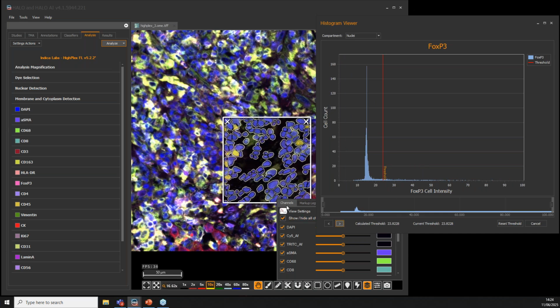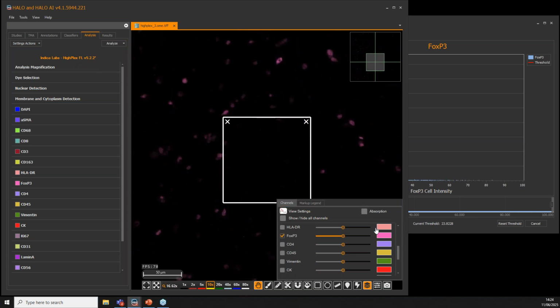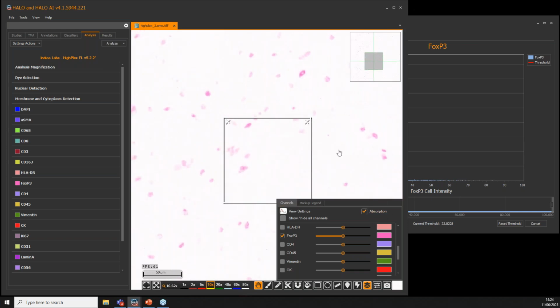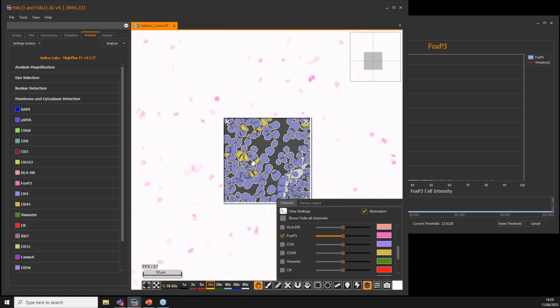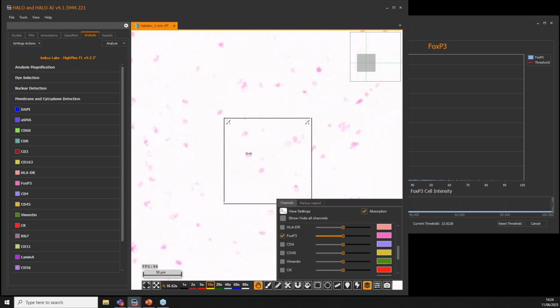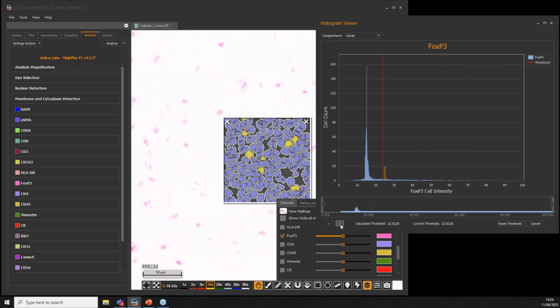And if you want to verify that this is correct, you can always go back to, for example, the channel of interest. So that it's easier to see, I'm just going to go to an absorption mode. This is a mode you can use to look at cells in a pseudo bright field fashion. And you see that all those cells are being recognized quite correctly here. You can also choose what compartment is being thresholded upon.